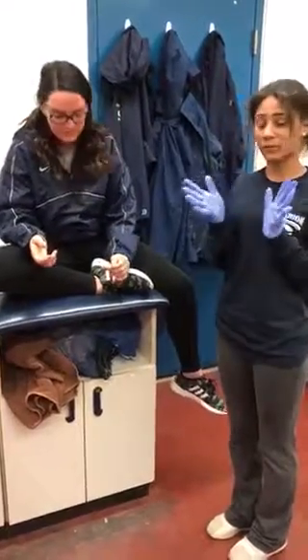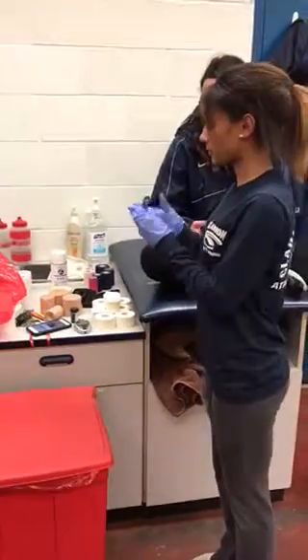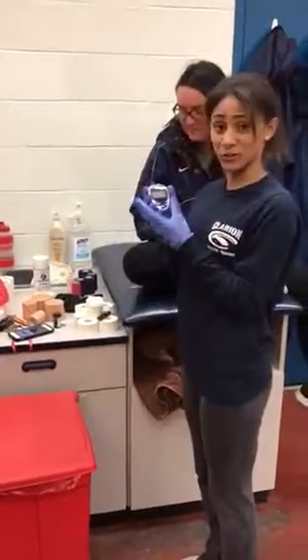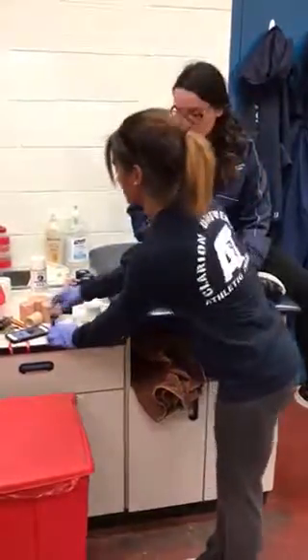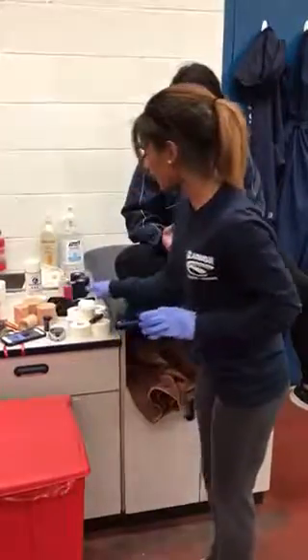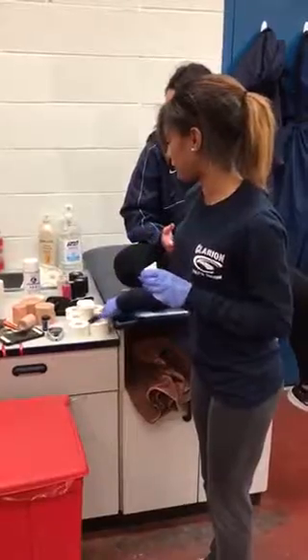idea. At first I put on my gloves for the glucometer test, and then prior to this I put in the needle for the, what pokes to get the blood. Here's the glucometer. Here's the test strips, and I made sure that they weren't expired. And then I have a gauze pad, an alcohol pad to clean her finger, and a band-aid for after.